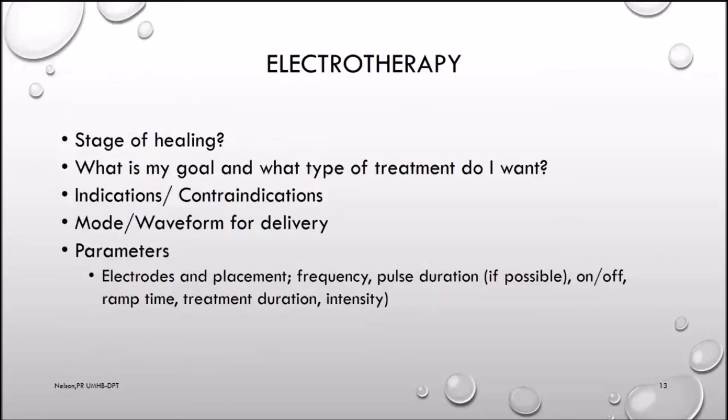So as we think about electrotherapy, we need to consider the stage of healing, what your treatment goals are, and what type of treatment do you want. Do you want sensory? Do you want motor? Do you want muscle pump action motor? Do you want muscle strengthening? Do you want noxious stimulation?